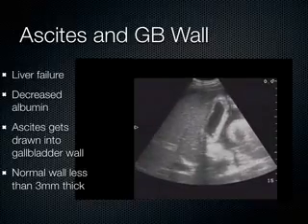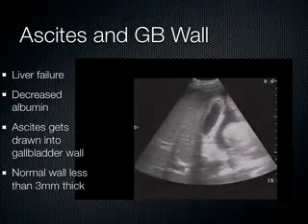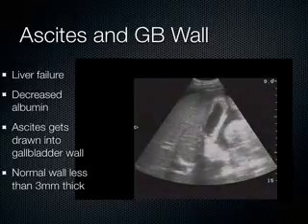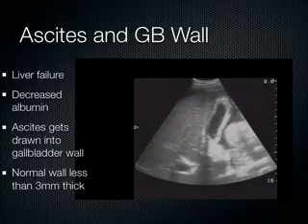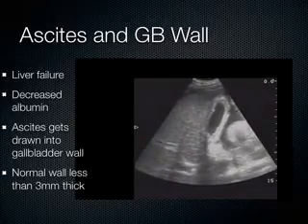So what happens when that happens is the gallbladder contracts down and the wall itself appears falsely thickened, which is why if I'm really curious about a patient's gallbladder wall, I want to measure it. I try to do it if they haven't eaten for at least 4 or 5 hours. That's the reason why we do that sometimes.